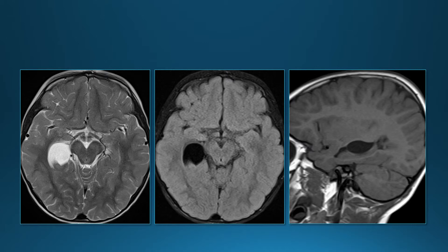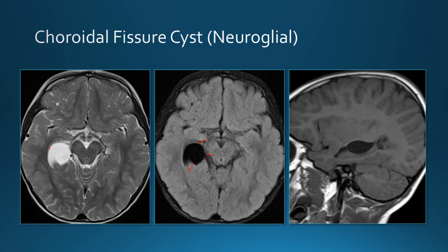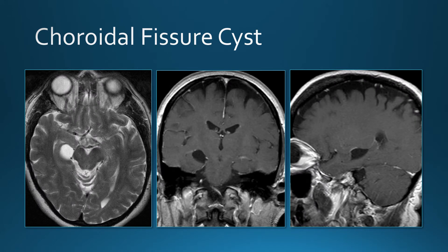This patient has a cystic lesion in a very characteristic location — iso-intense to CSF on all pulse sequences. It's right between the cerebral peduncle and the temporal horn. This is a choroidal fissure cyst, a neuroglial type of cyst. These are asymptomatic lesions — you leave them alone. The characteristic feature is the location: in the choroidal fissure between the cerebral peduncle and temporal horn. They don't enhance with contrast and are iso-intense to CSF.